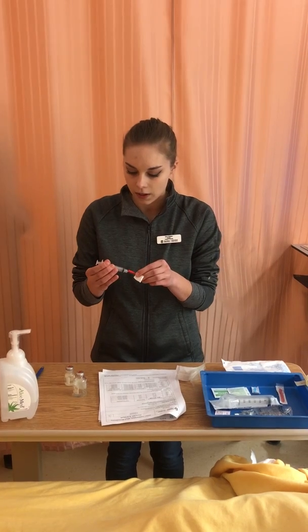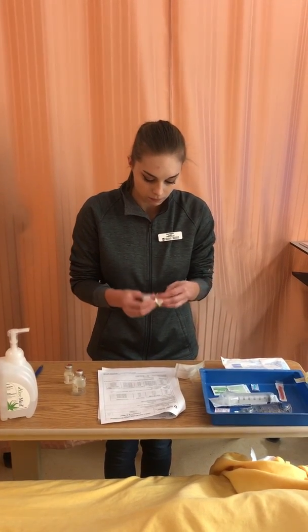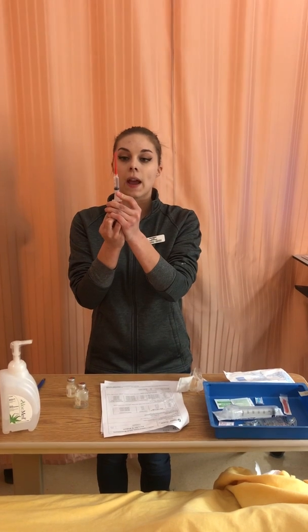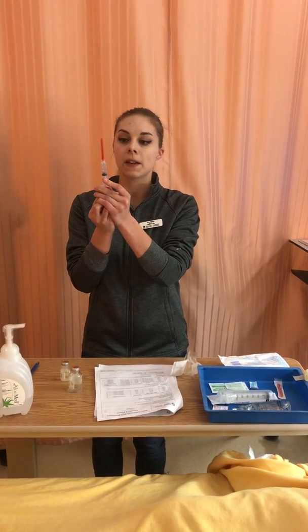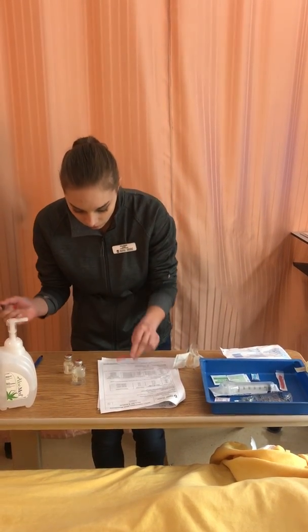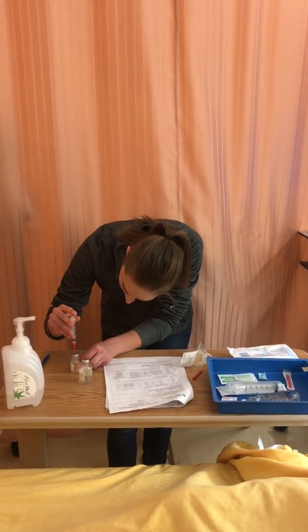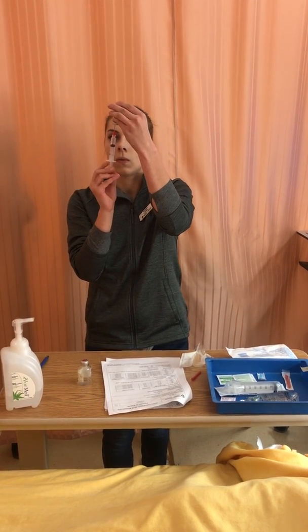Making sure not to touch anything. So I'm going to withdraw air first. My syringe goes up in increments of 2, but because it's sterile water, I'm able to estimate 3.1. I'm going to inject my air, and I'm going to maintain sterility. And then I'll put it here and withdraw.